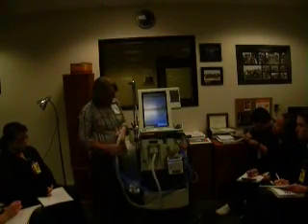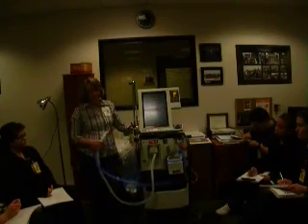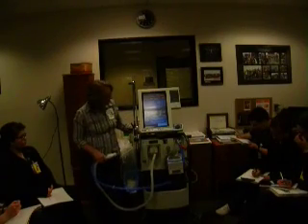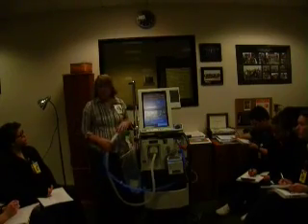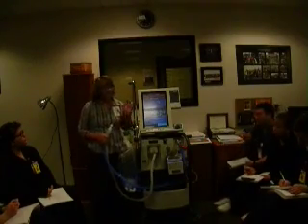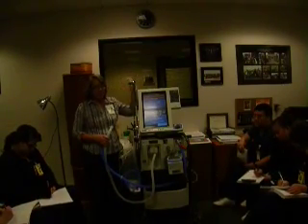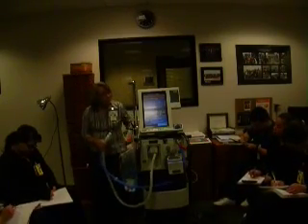Press accept. So the vent is going to shut down and restart on its own. It's part of this process, so that's normal. And then you're going to have the option to do an SST again if you wanted to, but of course we don't want to. And then new patient or same patient. This is the only ventilator that doesn't have standby. All the other vents have standby, and that's just kind of like a pause mode. You can say, put everything on hold. I need to not ventilate my patient for right now. That could be used in multiple different circumstances.